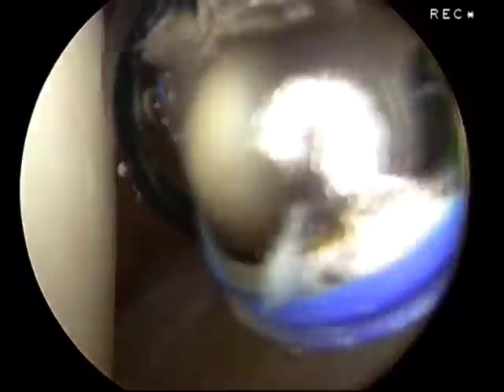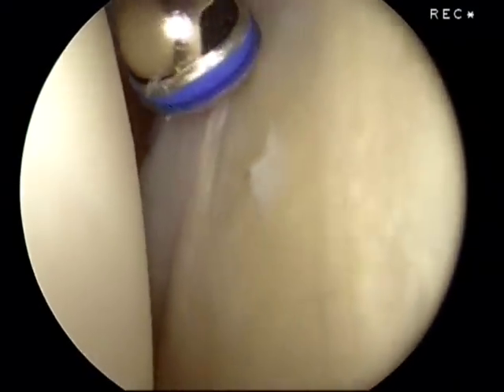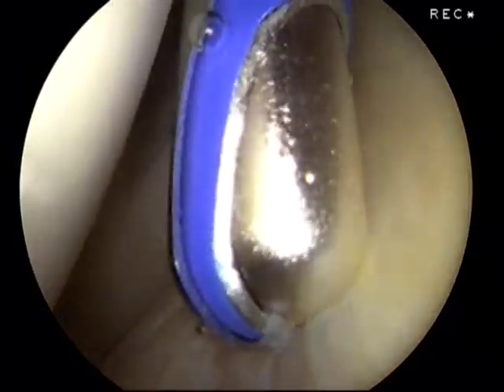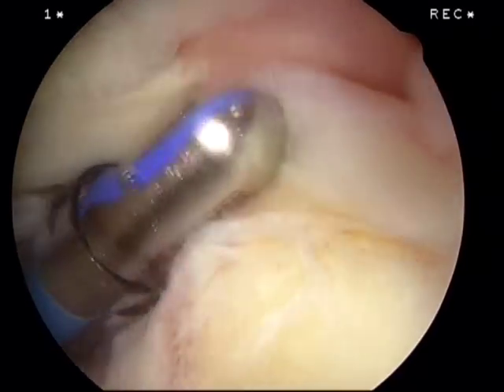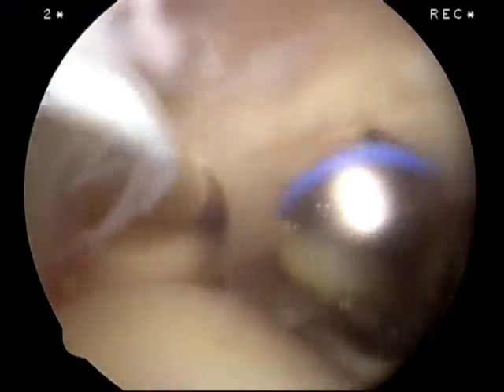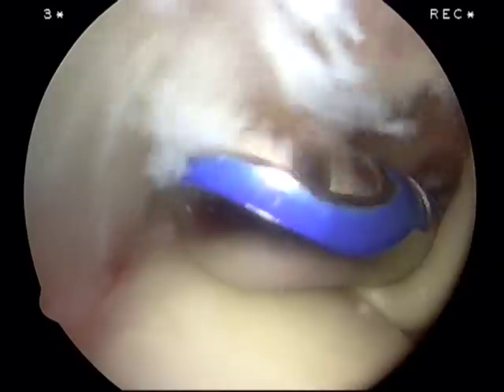It's very easy to move around even with a larger shaver like this. If we want to look inferior, we'll get some distraction and that opens up. We can easily get our shaver to pretty much any position along the glenoid with some distraction. Superiorly, we have the biceps and the biceps anchor, which looks normal. We'll follow that on the underside of the rotator cuff over to the humeral head, then come back to the rotator cuff — a little bit of fraying, quite easy to clean any loose pieces off with the shaver.